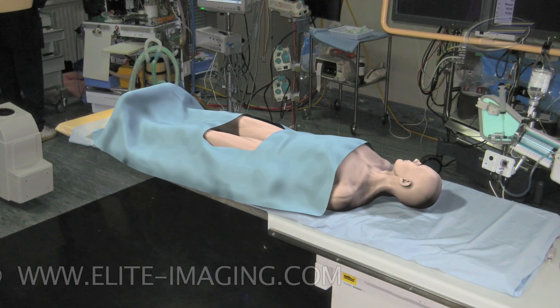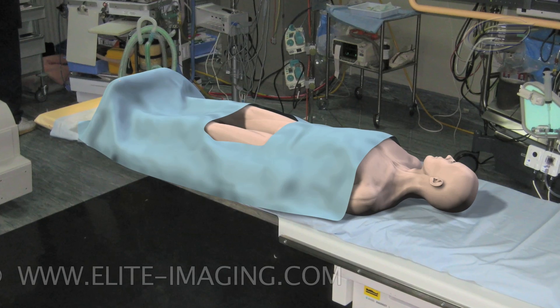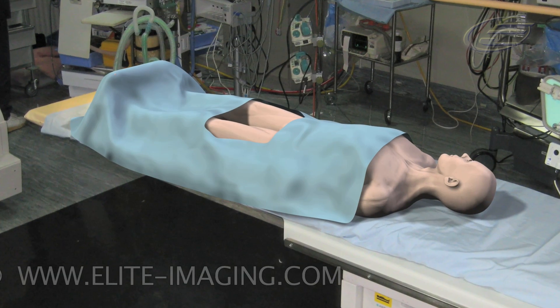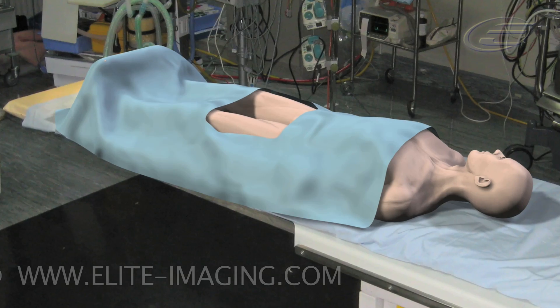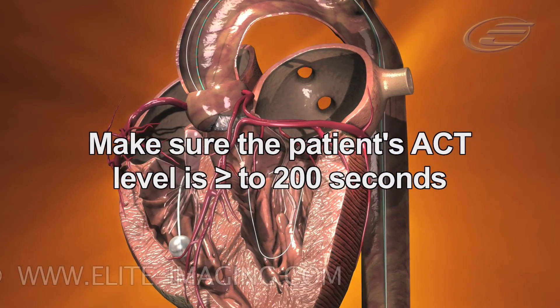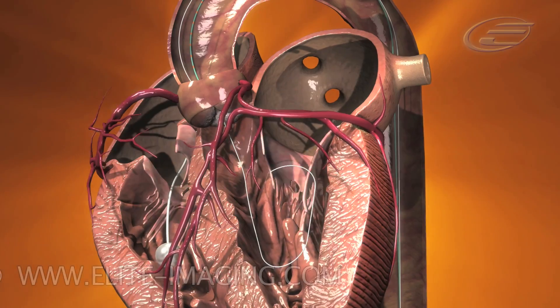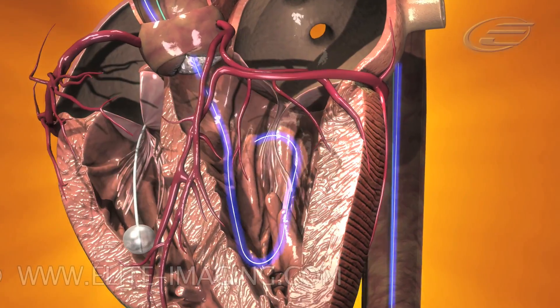Before we begin, let us confirm proper setup and configuration of all instruments and confirm that the patient anatomy is ready for the Medtronic CoreValve system. Make sure the patient's ACT level is greater than or equal to 200 seconds. Confirm that the super stiff guide wire is contoured to the inner cavity of the left ventricle.